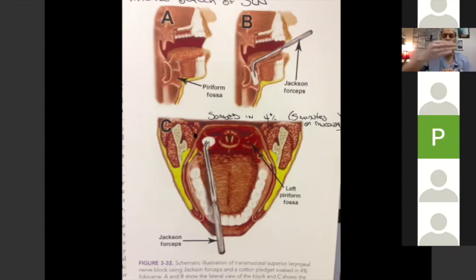So it drips down the tongue and goes to the area where it needs to go. Again, that technique is more glossopharyngeal. Some people will even paint the posterior third of the tongue with a lidocaine paste. But I don't get into all that because we want to keep it simple. So the way I topicalize the superior laryngeal nerve is I directly spray it through the fibroscope when I see the cords.